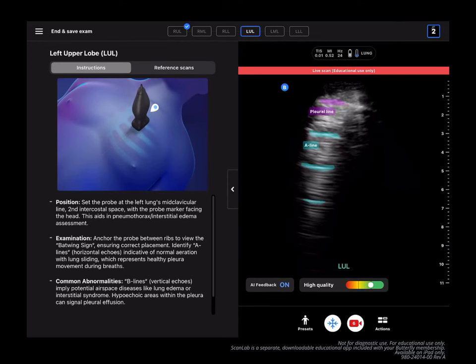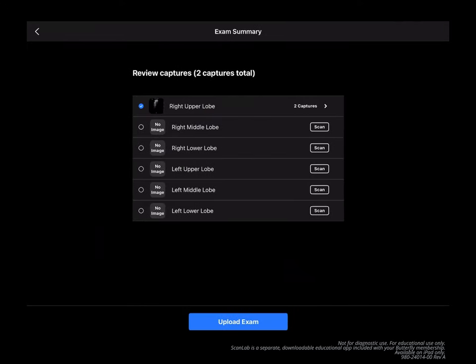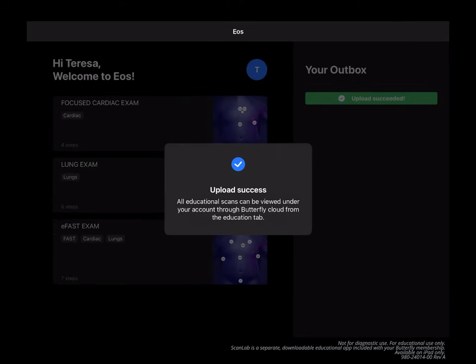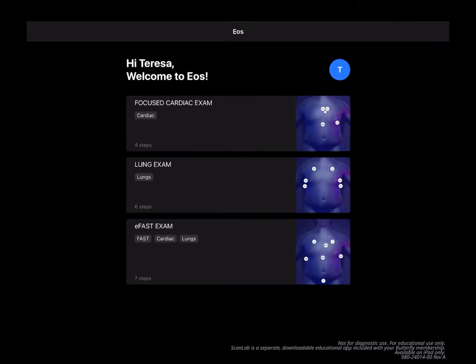Once you're done with the practice exam, you can review your captures or acquire more captures for any of these steps before uploading your exam. Your exam will be saved to your Butterfly Cloud in the Education section under ScanLab.